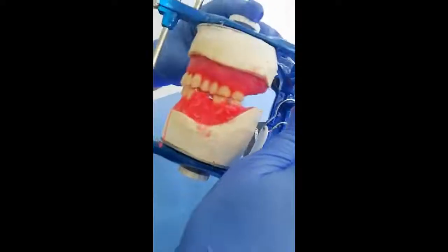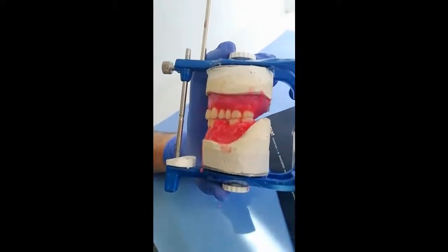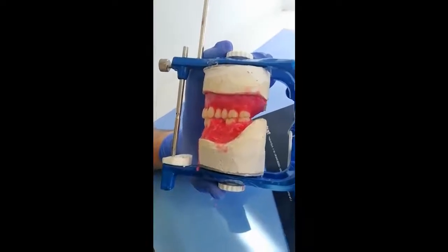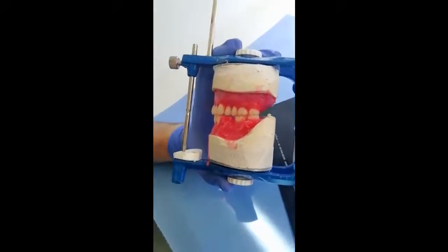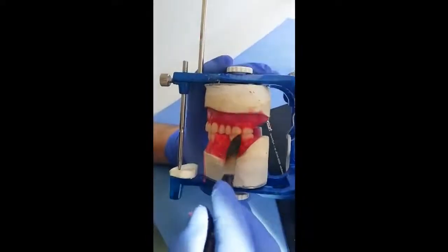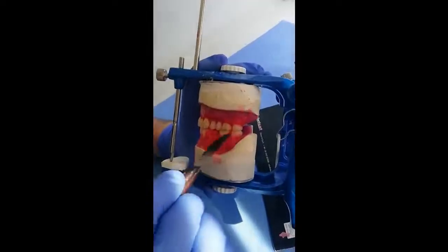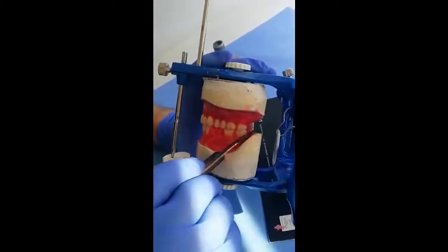Let me check the occlusion now. We can see that we achieved proper occlusion in the centric position between the lower or mandibular second molar and the opposing maxillary second molar.